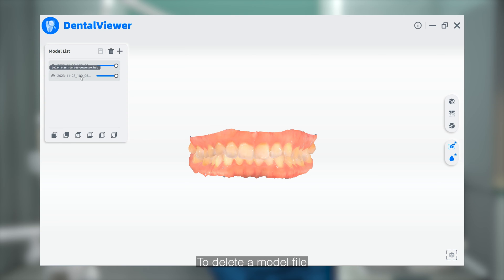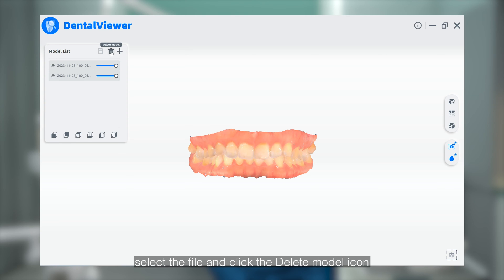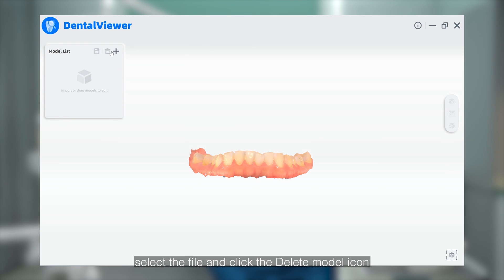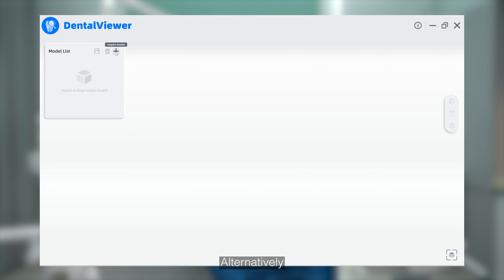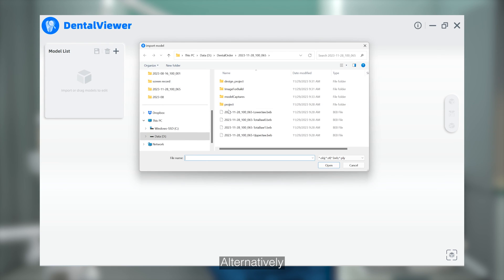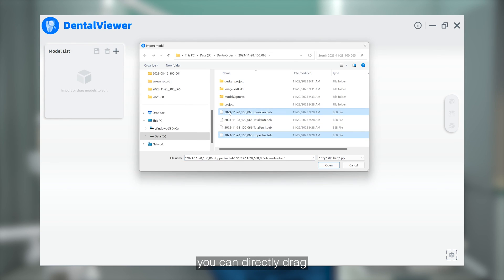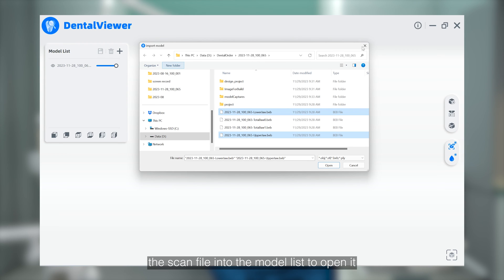To delete a model file, select the file and click the delete model icon. Alternatively, you can directly drag the scan file into the model list to open it.